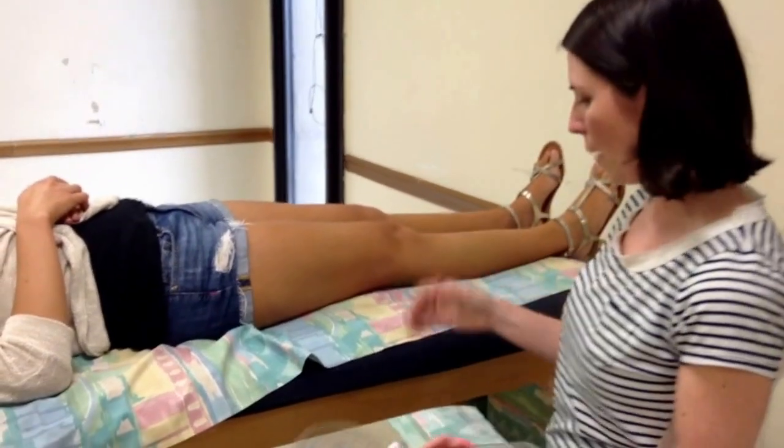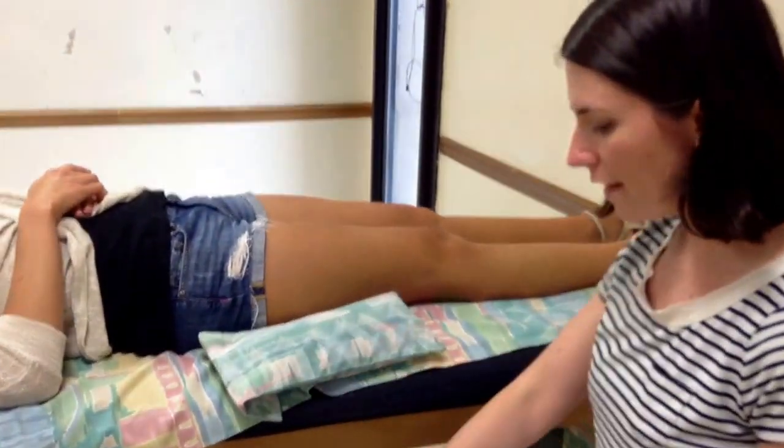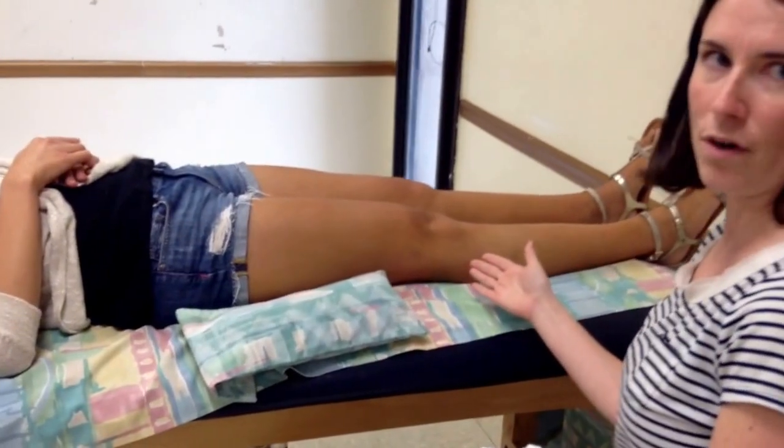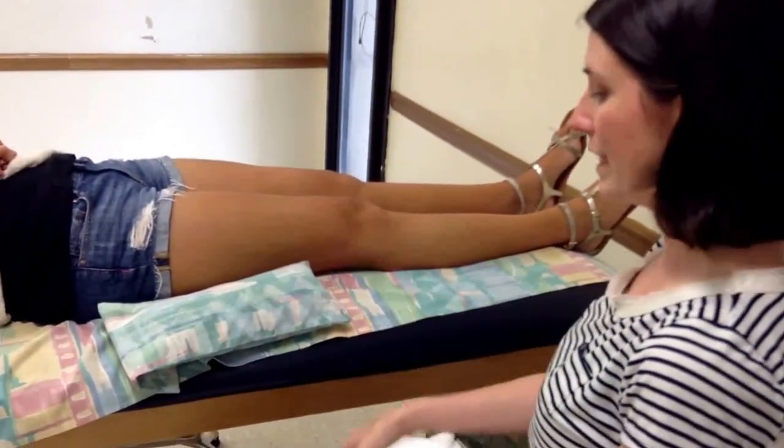For this measurement, the patient is going to be supine. Similar to the elbow, she could have hyperextension of the knee, but we're never going to know it in this position because the bed limits that.